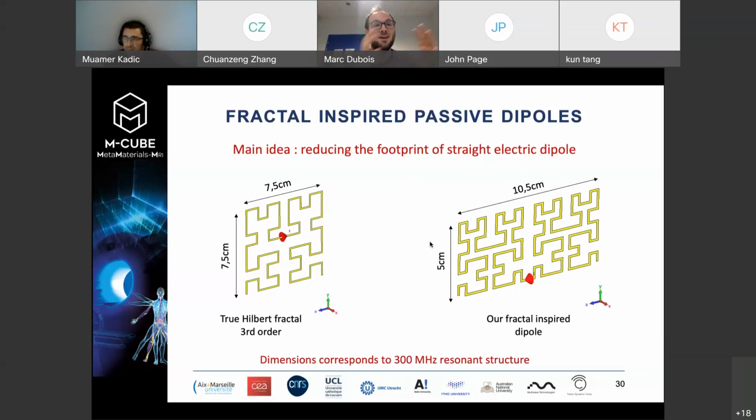And on the other end, if you want to democratize MRI, you clearly want to have something that is less costly, because today, the rule of thumb is really approximately 1 million euros per Tesla. So it's quite expensive machine. And in fact, if you want to install this in third world countries or developing countries, the problem won't be just the upfront cost, but the maintenance. Because as I said, the scanner is always on. So you have to keep it cold, you have to keep it powered. Any power outage is a nightmare. So you want to be very careful with this.